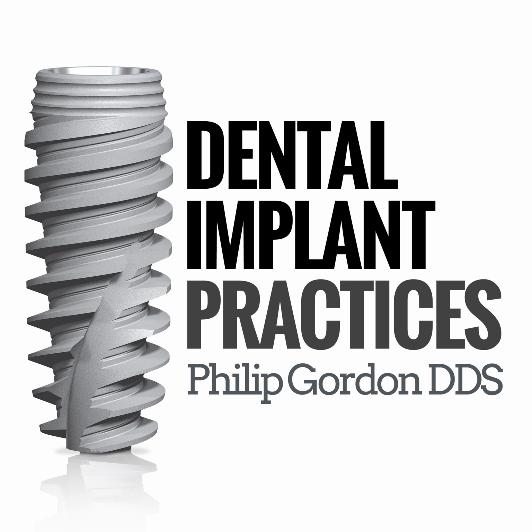One side note with implant drills, most implant drills are typically 1 millimeter longer than the implant. So if you're taking it into 10 millimeters, the drill actually goes in 11 millimeters. So always having 1 to 2 or 2 to 3 millimeters of clearance around the end of your osteotomy when you're cutting away from nerves or vessels, or the end of the bone is generally advised, because most implant drills are 1 to 1.5 millimeters longer, and they don't necessarily indicate that on their length. So that's something always to be aware of.